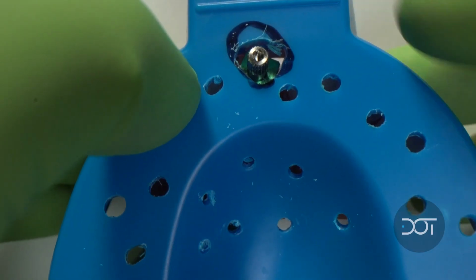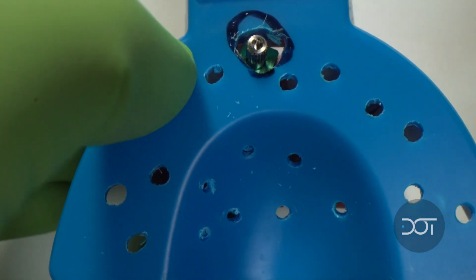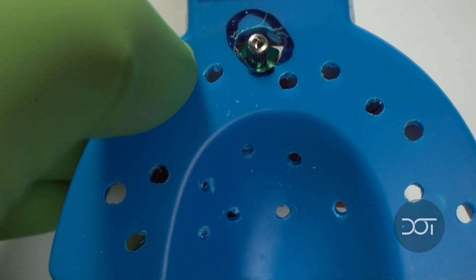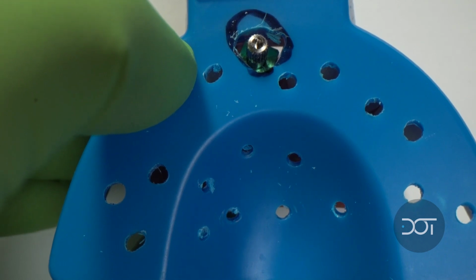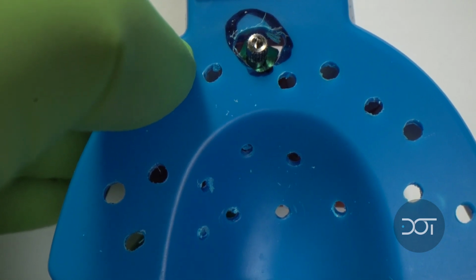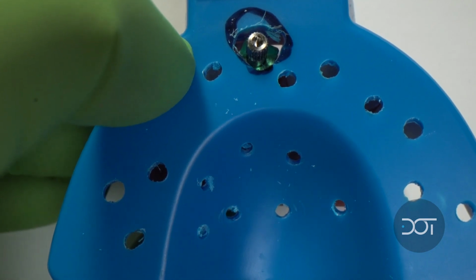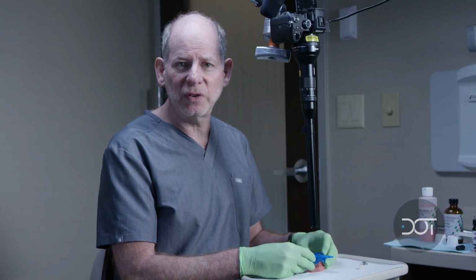Now once I've had this tried in the mouth, I'm moving the tray around to make sure that it's seated properly. Be careful, you want to make sure that the impression tray is going to cover over those posterior teeth and not going to bind on those. So make sure you have an appropriately sized tray because you do need to get an impression of the posterior teeth so that as they're building up this implant crown, they have a good occlusal index to make sure that they're working out all the functional issues that are necessary when they're making the crown. So in this case, we're just using a little sectional tray.